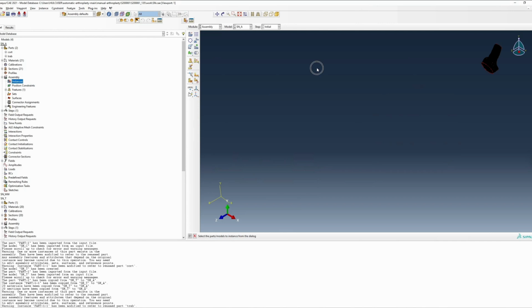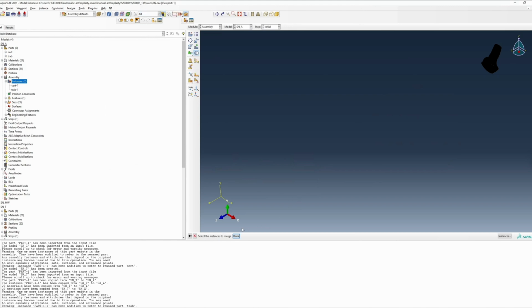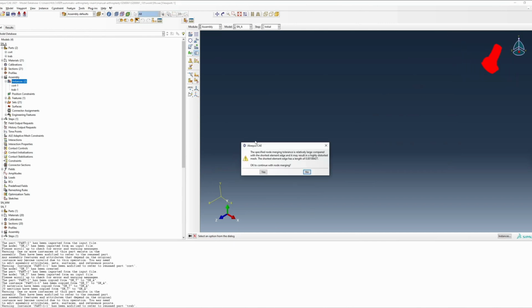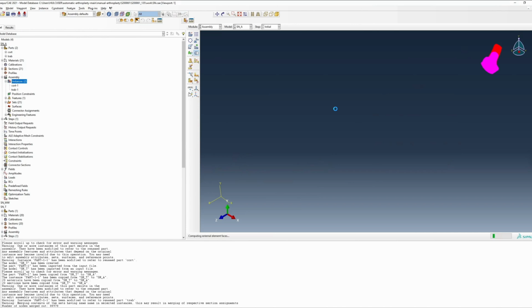Under the Assembly module, we can now use the Merge Cut Instances tool to merge our trabecular and cortical bone instances. When using the Merge/Cut Instances tool under the Assembly module, ensure that you are merging both your mesh and geometry while suppressing original instances, retaining your intersection boundaries, and reset your mesh merge nodes property to boundary only with a tolerance of 1 micrometer.